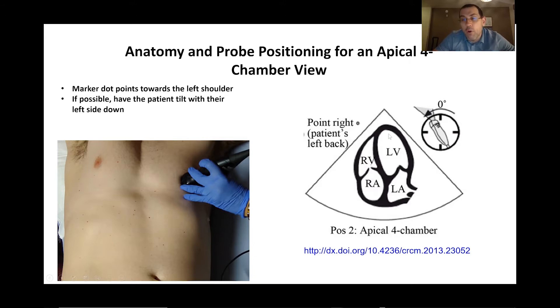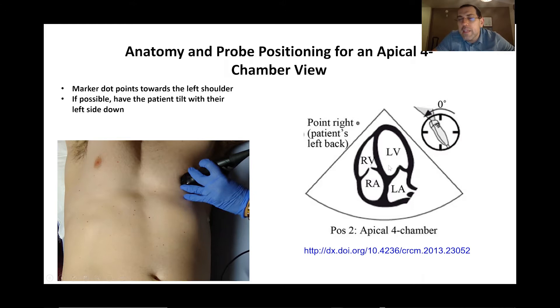What are we looking at? We'll be looking at the left ventricle on the right side of the screen, and the left atrium separated by the mitral valve. On the left side of the screen we'll see the right ventricle separated by the tricuspid valve, and the right atrium. We should see that the left ventricle is bigger than the right ventricle — the right ventricle is usually about 60% the size of the left, and the two atria are about the same size.